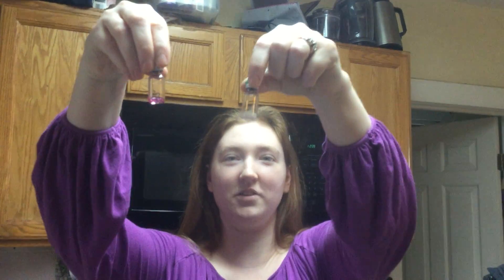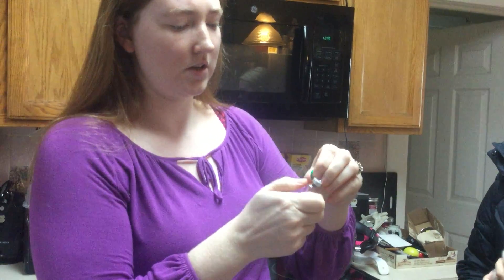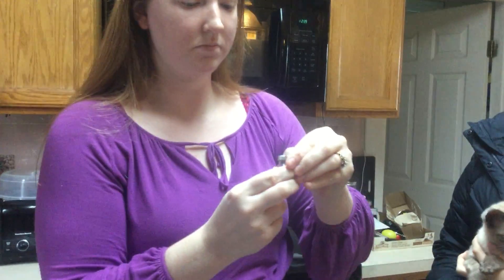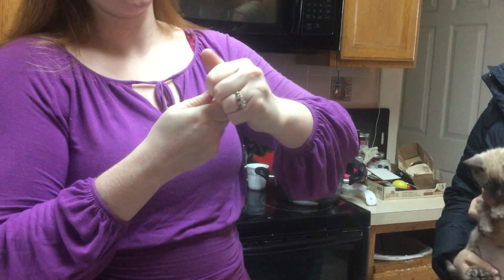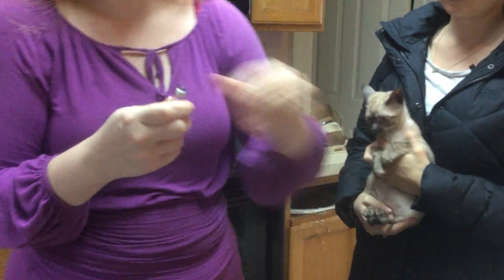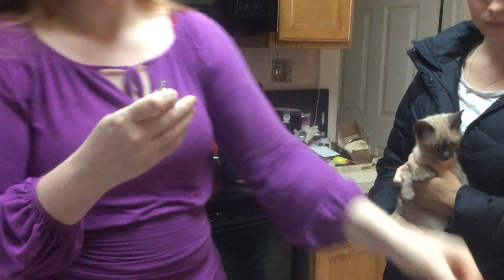Again, you can see the liquid versus the powder. You want to take the cap off — it's got a metal seal and there's a rubber stopper in it. This is actually the first time I'm doing this too, so this will be a first for everybody. We need to pour the liquid into the powder — keep in mind you don't want to pour the powder in because otherwise the powder goes everywhere.